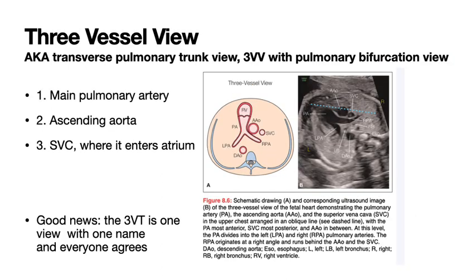All right. After that, the first one was the 4-chamber view. We tilted up a little bit and got the left ventricular outflow tract, or 5-chamber view. Now we're going to go up a little bit higher, and we're still basically using that apex as the hinge.